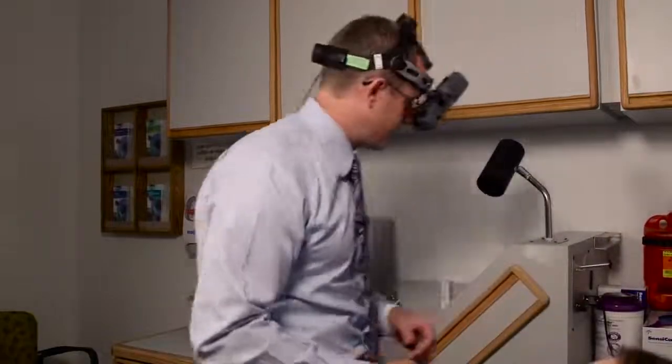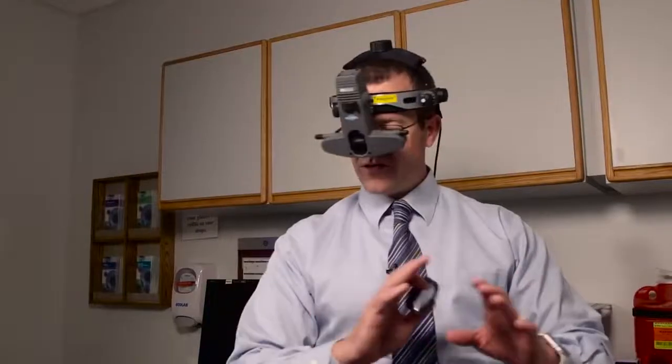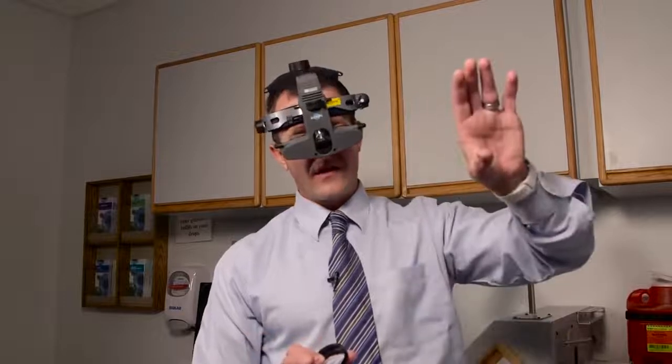So next I'm going to go to my patient who's been patiently waiting for us. Again, key concept: do the exam the same way every single time. I start with the right eye, then I go to the left eye. There are different ways this can be done, but what I do is I start superior and I go lateral, temporal, every single time, with both eyes. So on the right eye, I'm going counterclockwise, and on the left eye, I go clockwise.